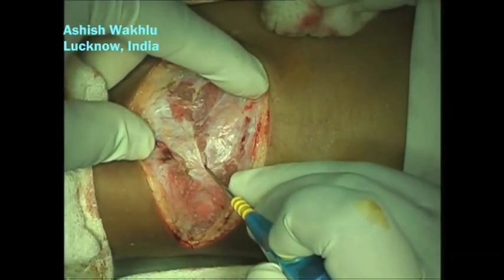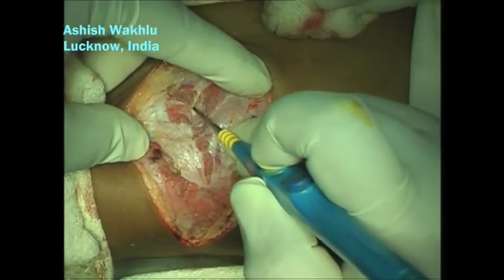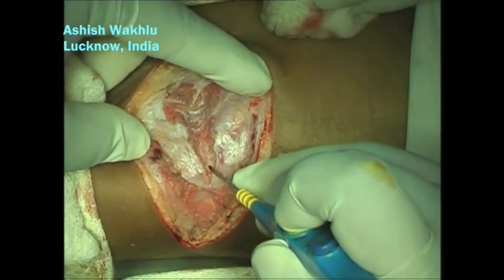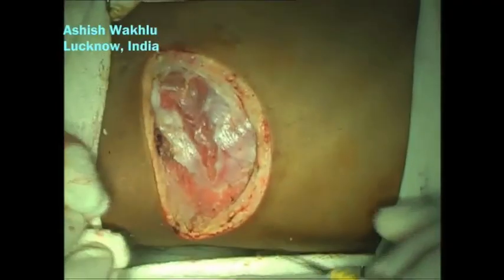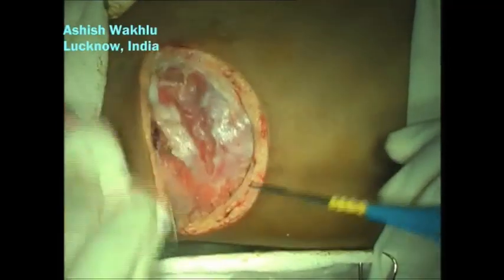Here we can see the serratus muscle undergoing division. There is some talk of preserving the long thoracic nerve of Bell to prevent subsequent winging of the scapula. However, with our experience of esophageal atresia, we have not seen winging of scapula in many patients.